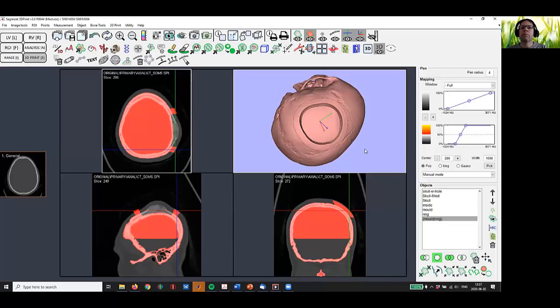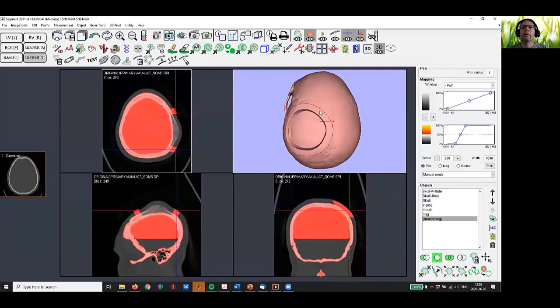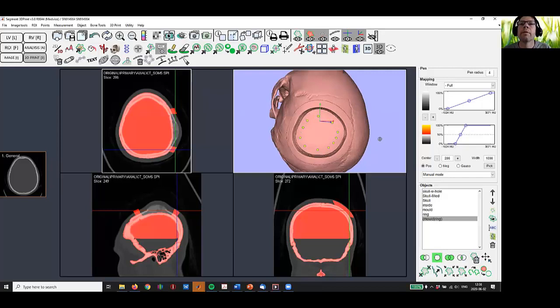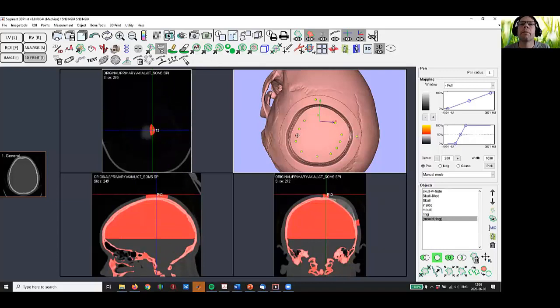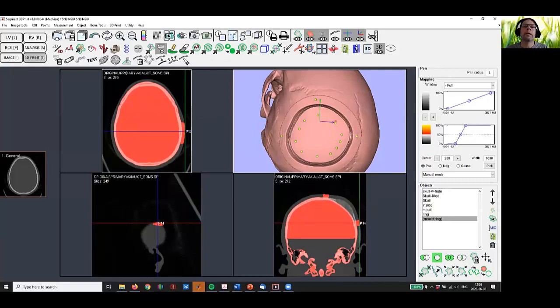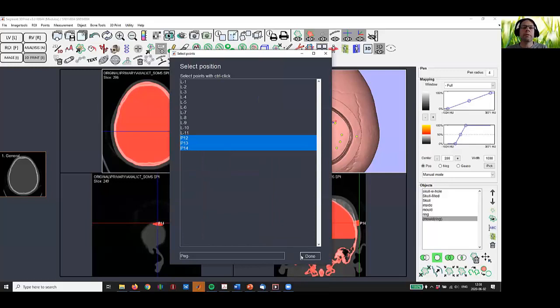Now we want to place some anatomical markers so we can use them for neurosurgery, for neuronavigation. So something like this. So again, we use the point tool. So I put one point maybe here, one here, and then I can make what we can call sort of pegs on those. So we want to drill a hole maybe 10 millimeters down and 15 up, and then let's make it 3 millimeters diameter.